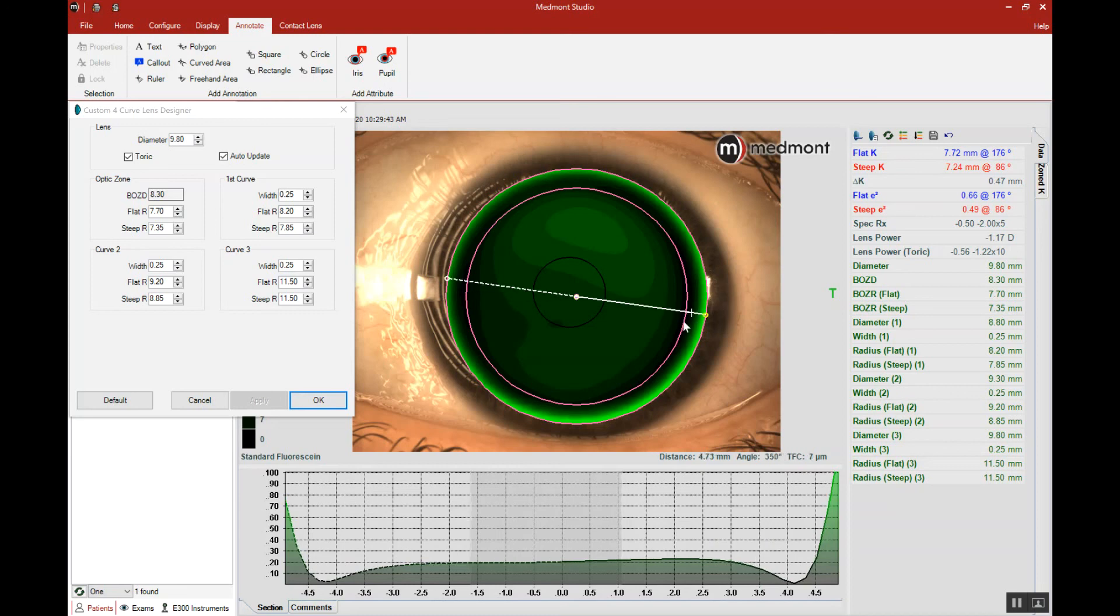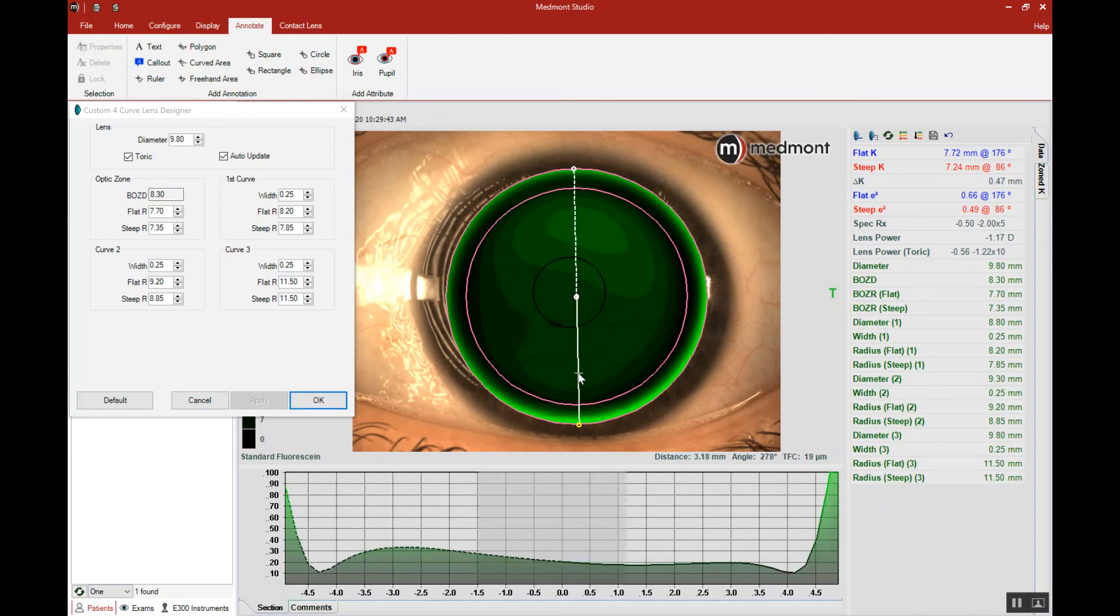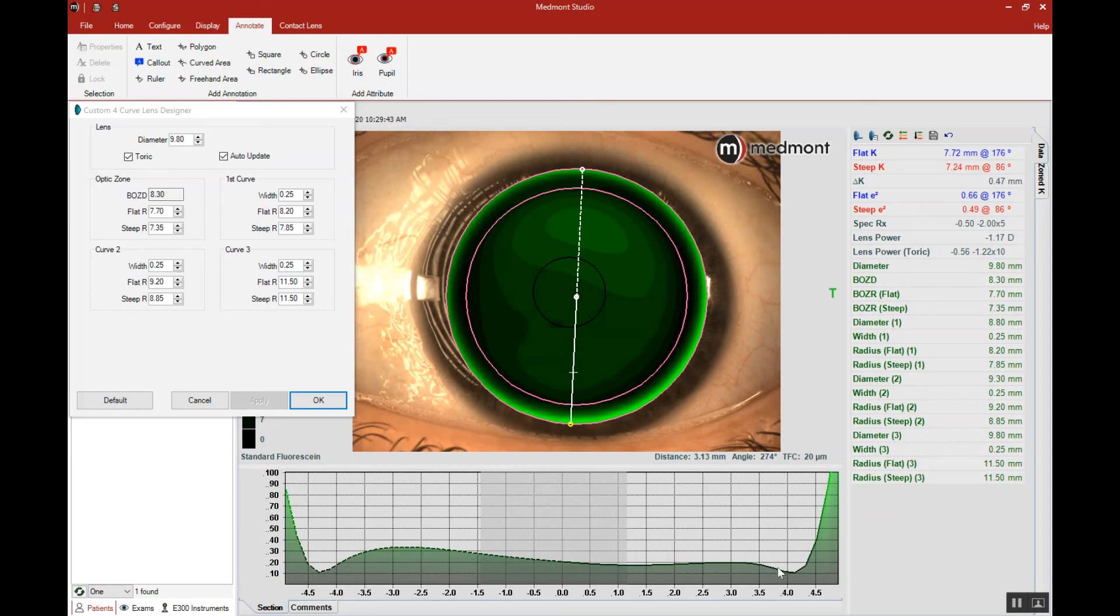Then by using a radius along the steep axis that will best match the surface, allowing for a tiny fluid layer where the lens can freely move across that vertical meridian with each blink, that should promote a healthy tear exchange and an ideal contact lens fit.